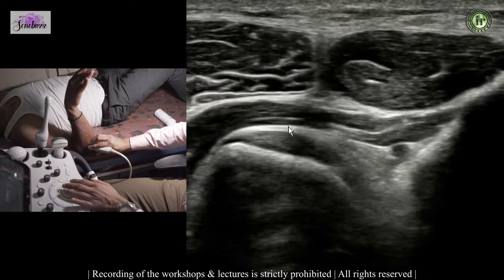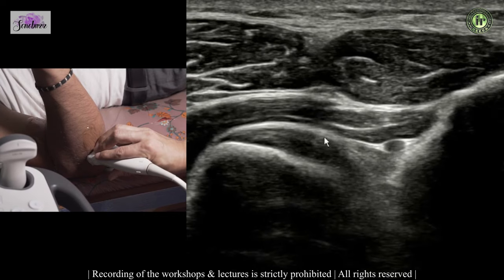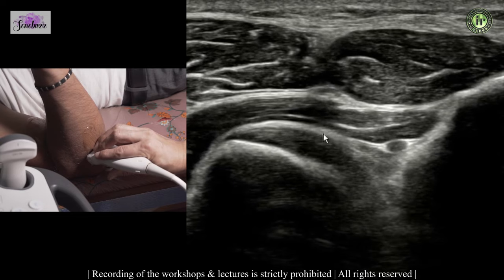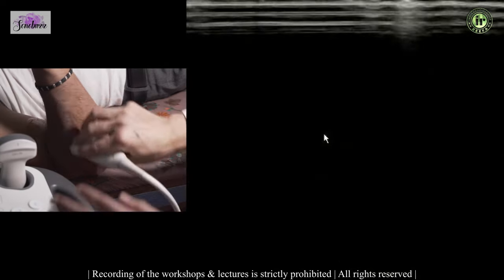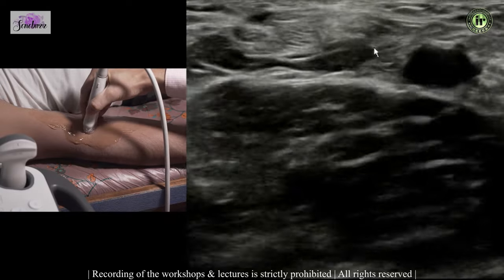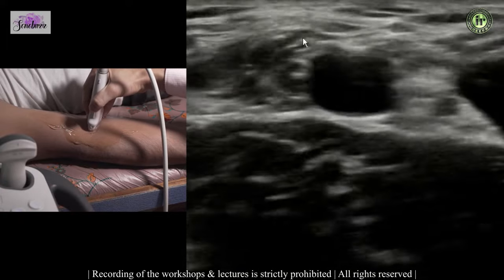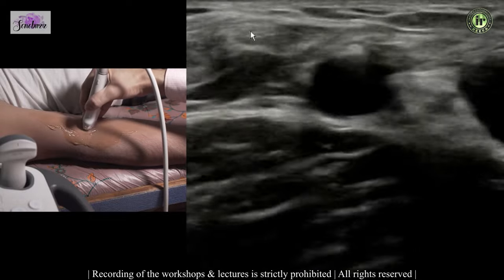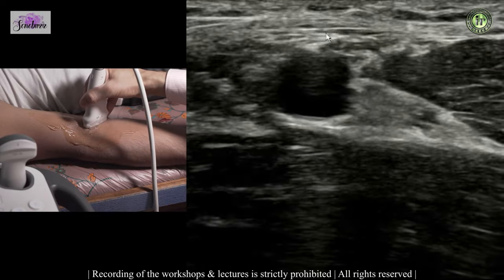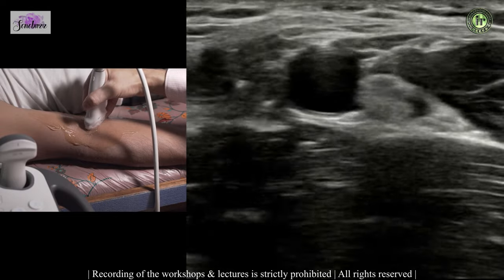When giving local steroid injections around the distal biceps in the bicipitoradial bursa, the needle should come from the medial side and the steroid should be deposited within the fat plane so the entire tendon is bathed. After seeing the distal biceps, we go back to the same position, decrease the depth, and take the focal spot up to see a thin structure coming from the distal biceps tendon going into the subcutaneous tissue — this is your lacertus fibrosus, which hooks the biceps tendon into the fascial plane, lying over the brachial artery and pronator teres muscle.